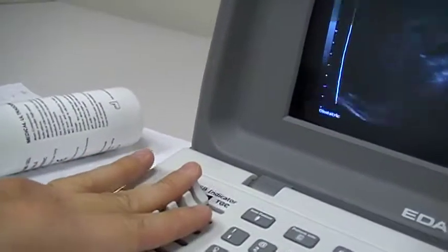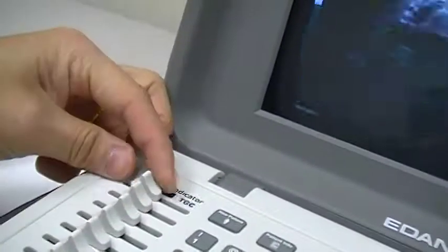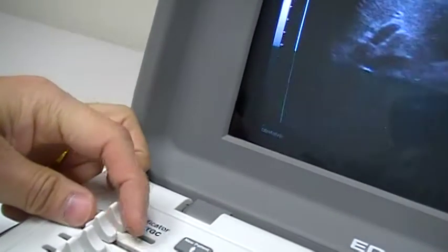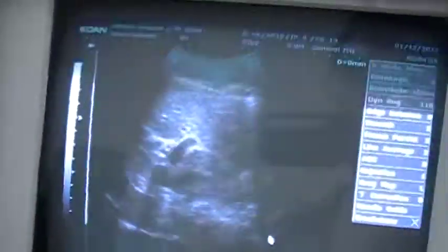You can also adjust the TGC slides here. For example, if you want to enhance the far field, move that slider a little to the right. If the near field is too strong, move that slider to the minimum position. You can change the direction and see the corresponding line change on screen.